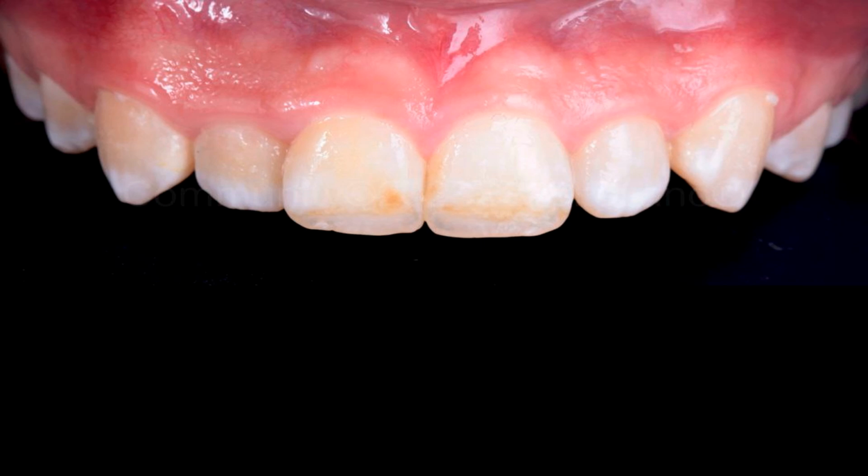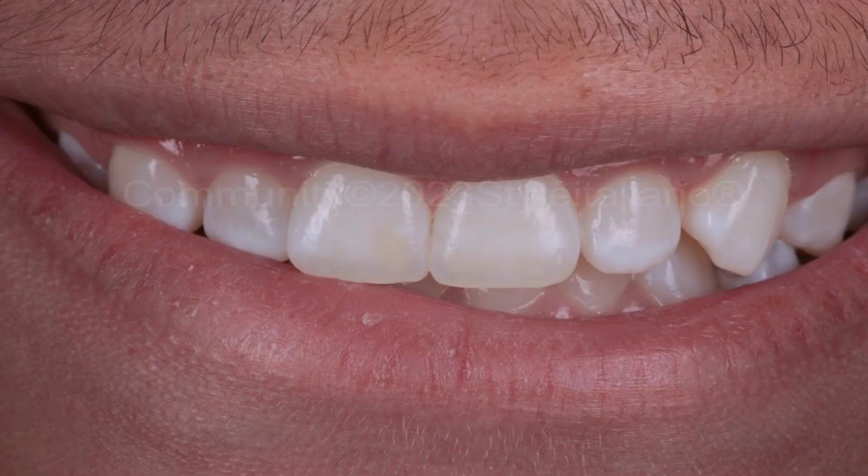We know that this technique only treats the white spot, not the chromatic spot. So we must do home bleaching for the patient, with 16% carbamide peroxide tray-based home whitening for 14 days. Then we will have this result.